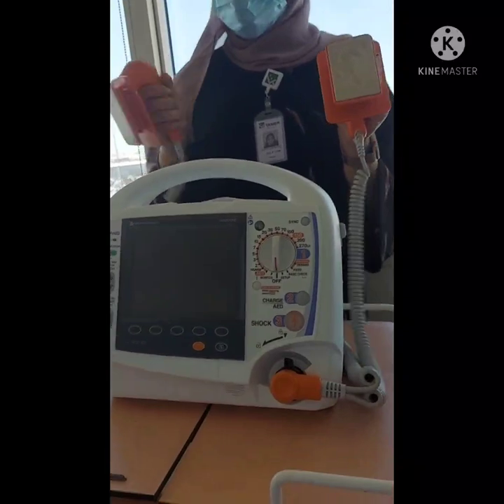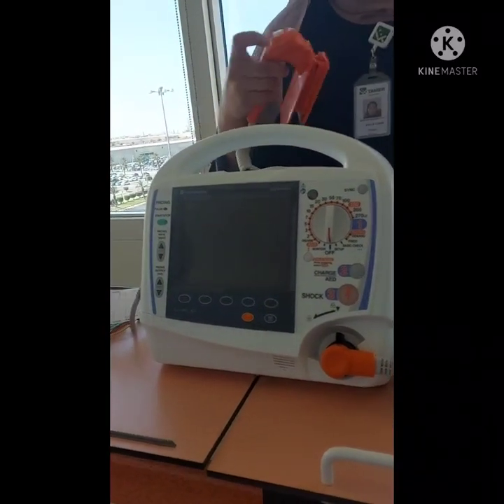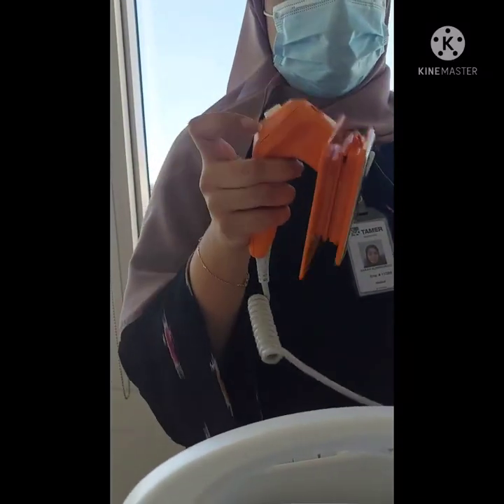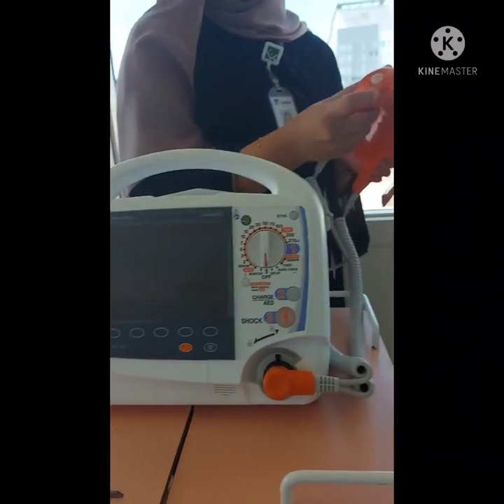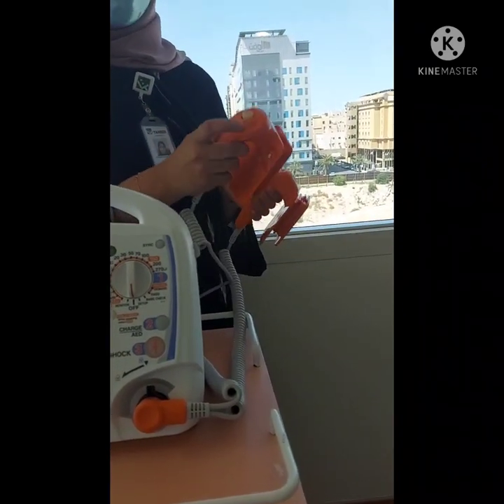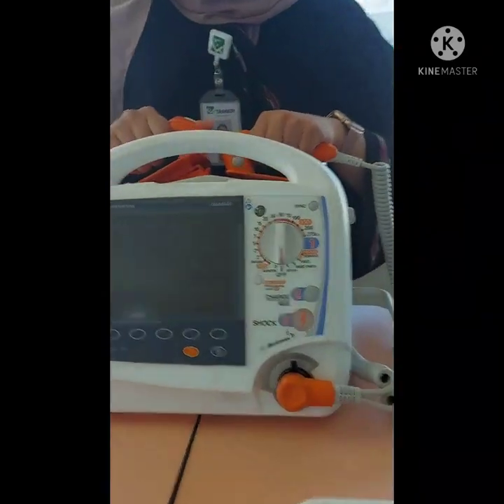Also, there's another thing I'm going to show you in a minute when we turn on the defibrillator. It is this one. This is an indicator of contact. So if the paddles are not in contact directly with the patient in the right way, it's going to turn red. If it's in good contact with the patient, it's going to be green. Okay? So I'm just going to put it back.